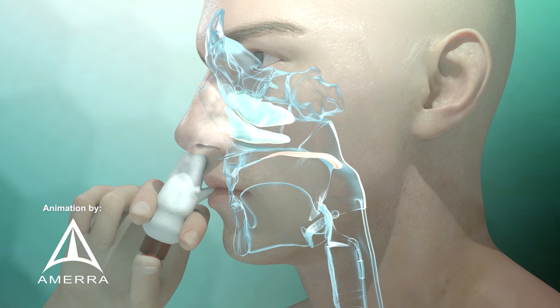The breath expands narrow nasal passages and deposits medication deep in the nasal passages, including the OMC near the middle turbinate, where many polyps originate.